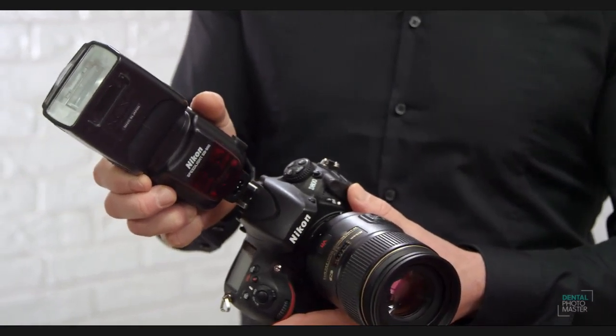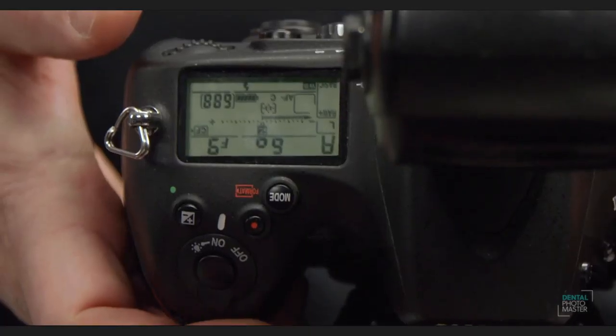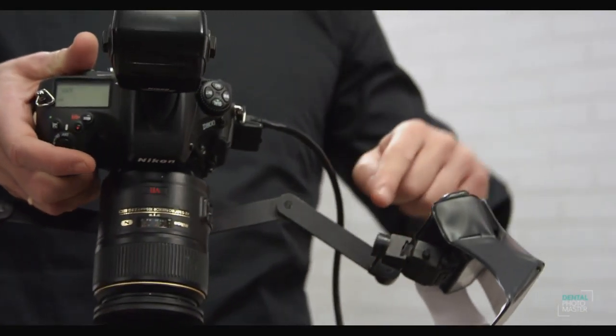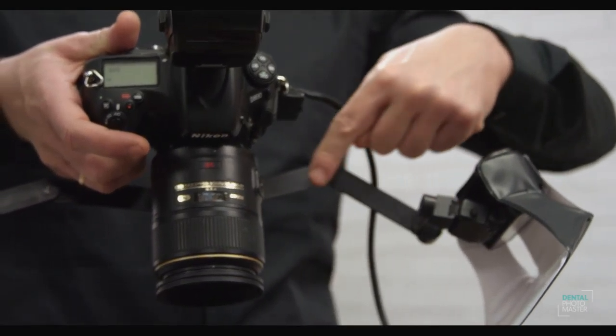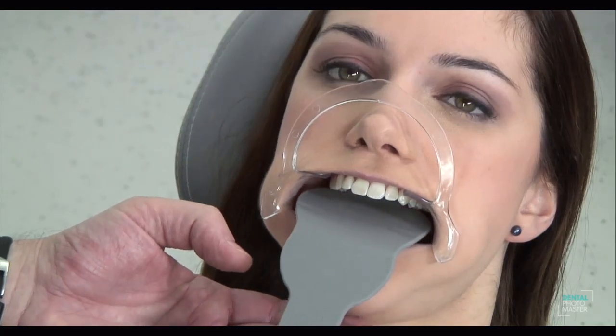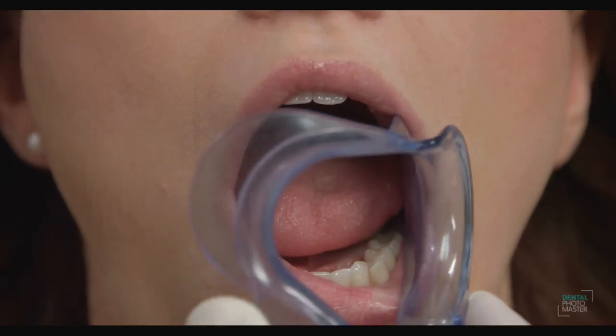I will show how to use your camera properly, how to position the camera with the lens to get the specific angle and to get the best results. I will also show you how to work with your accessories like contrastors, mirrors, and retractors.